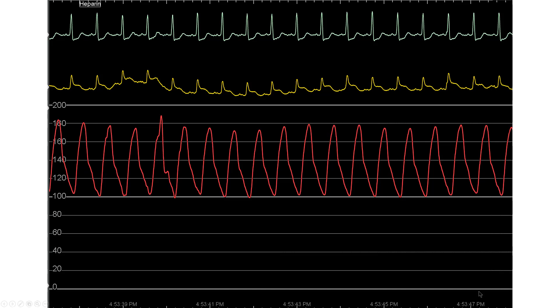The patient presented with inferior ST-elevation myocardial infarction. The baseline hemodynamics and EKG, when the patient arrived in the cath lab, are shown with ST-segment elevation with reciprocal ST-segment depressions.